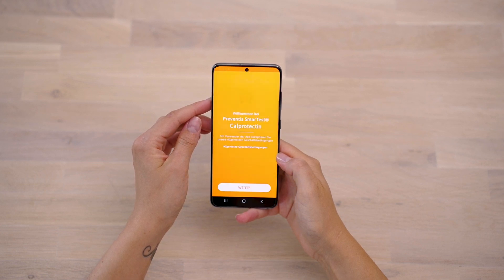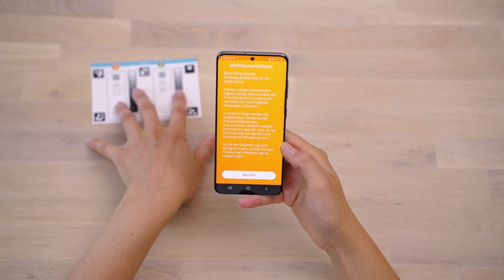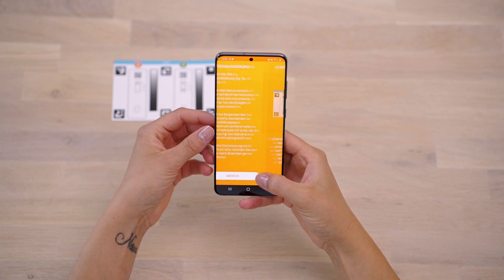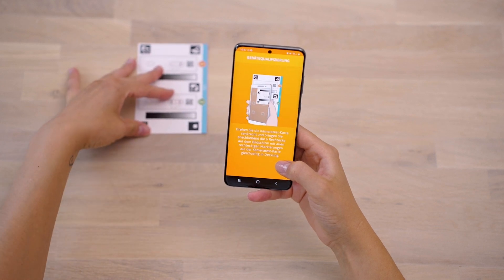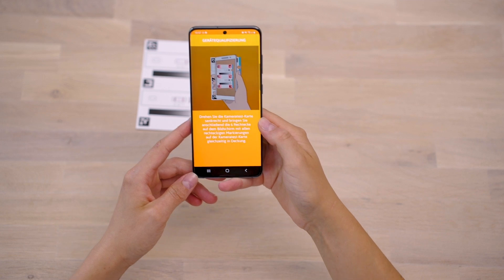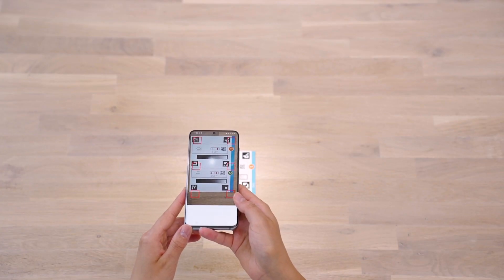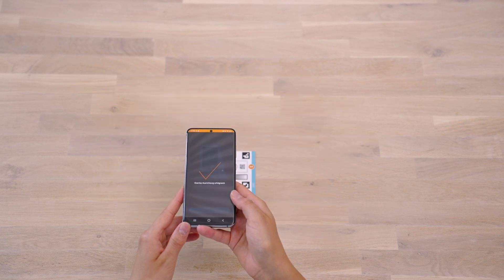If the smartphone model you are using has not been approved by us yet, you will automatically be forwarded to the device qualification. Here, our minimum requirements for the smartphone are checked for the evaluation. To do this, place the camera test card in front of you so that the blue bar is on the right-hand side. The outlines of the six squares now appear on the display. Align the template with the six squares on the camera test card and hold the smartphone parallel to the card. If the alignment is correct, the template will turn green.